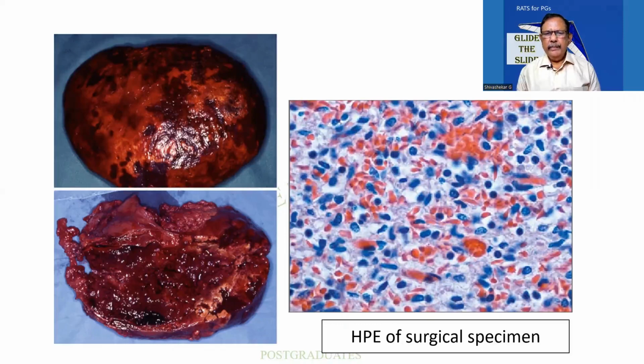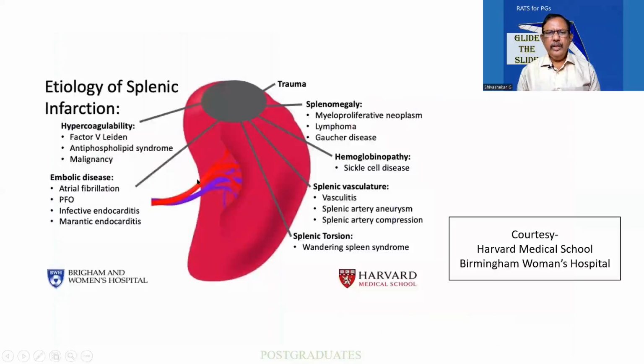The spleen. And I would like you people to again appreciate what is there in the slide. Are all the RBCs normal, or is there any other form of degeneration or a change or an inclusion or a tumor? I think you would have made the diagnosis. So it is. Anyway, as I told you earlier, there has been infarction in the spleen.